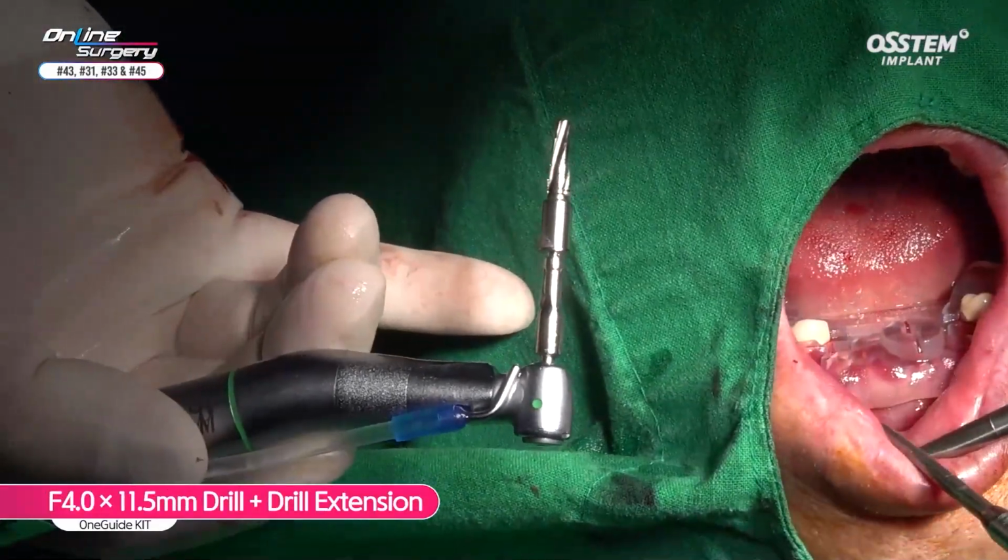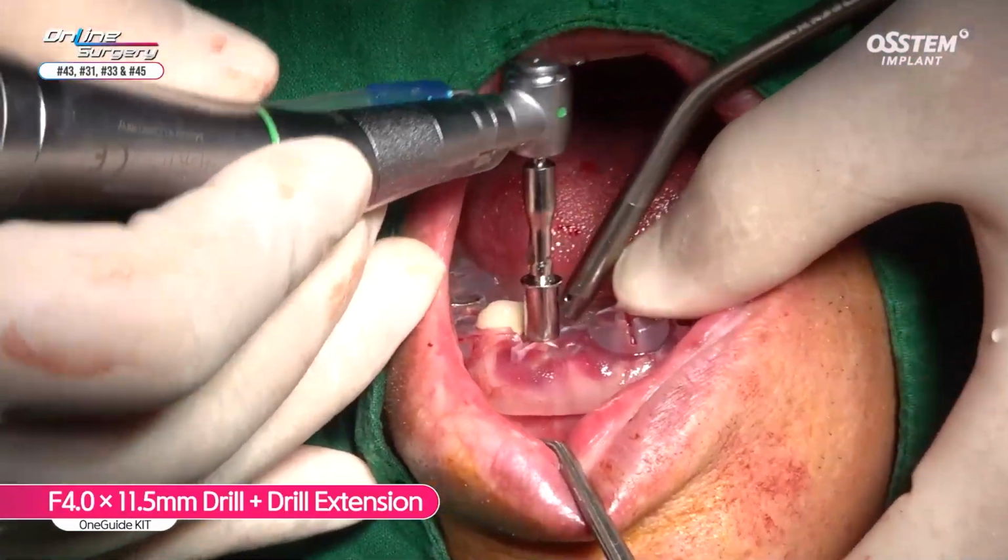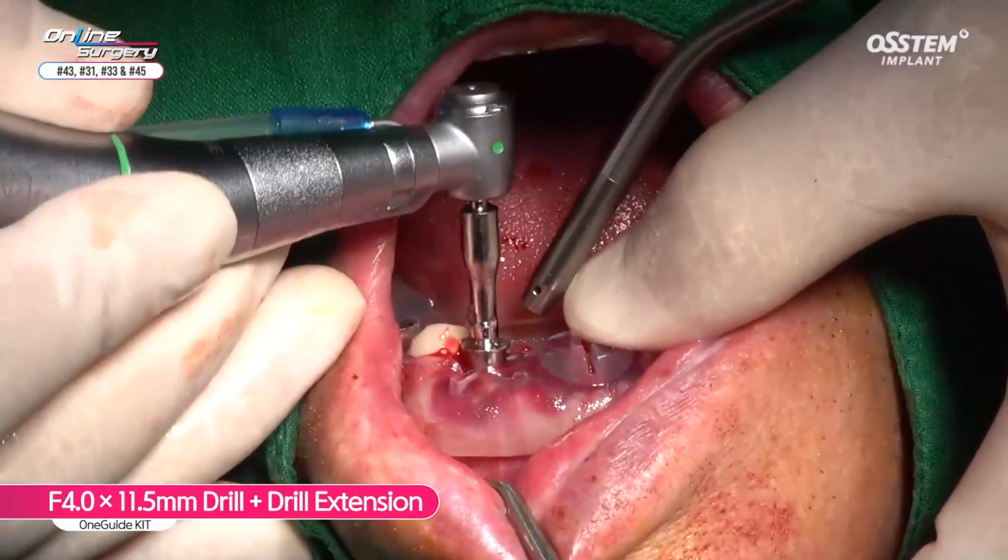I think there's a slight interference, so I'm going to drill up to 11 millimeters and then place a 10 millimeter implant.